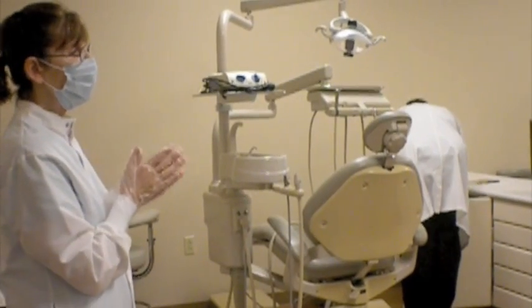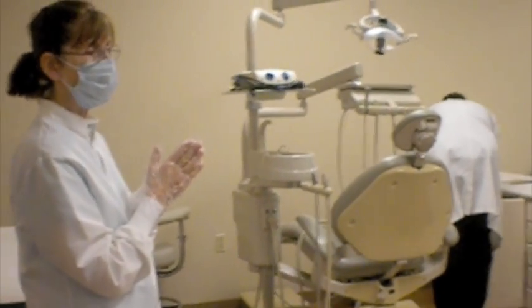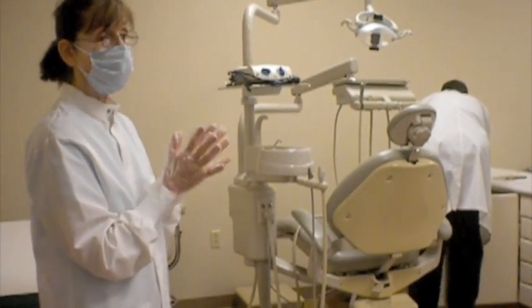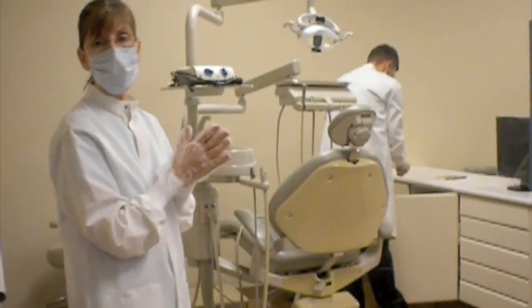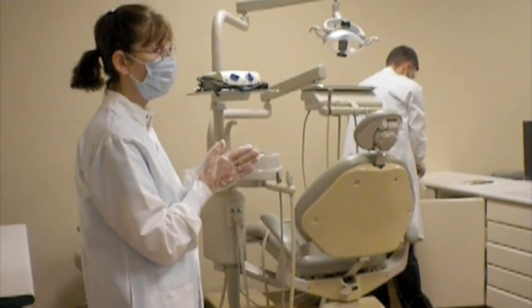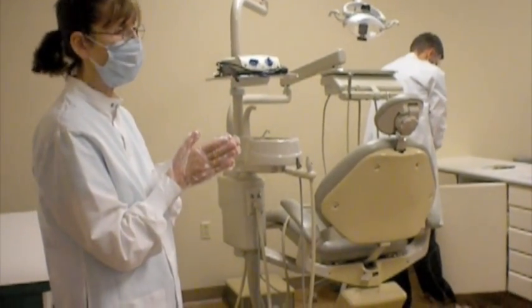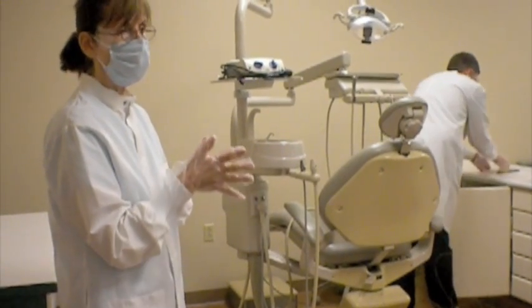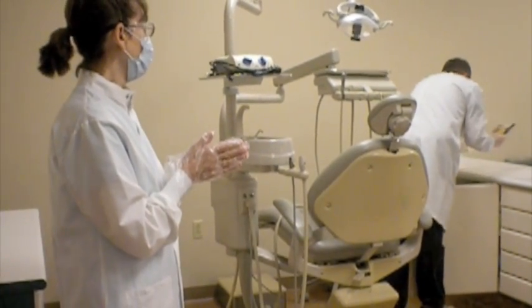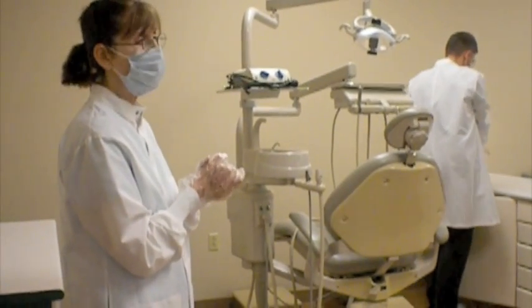All right, so once he puts them away, he's going to get back into what gloves? He has on clean overgloves. Utility gloves, correct? Those heavy-duty nitrile gloves that are going to allow him to begin that sanitization and disinfection process of the unit safely. So overgloves are away, back into the utility gloves.